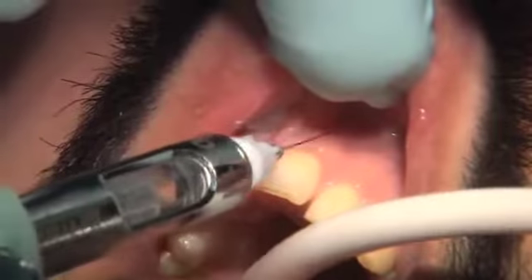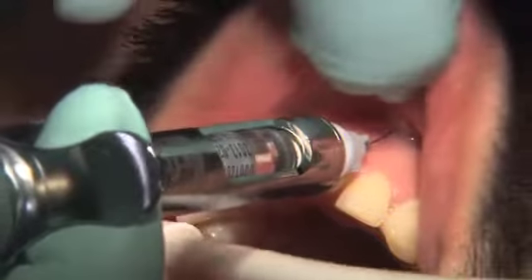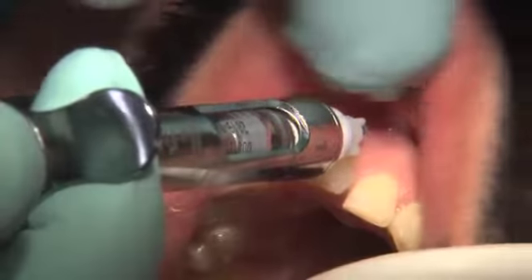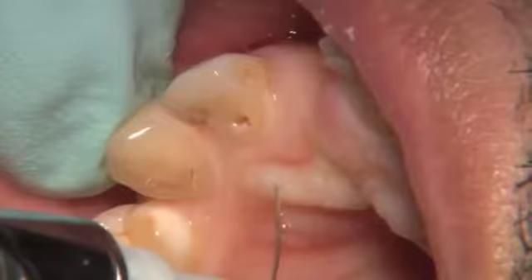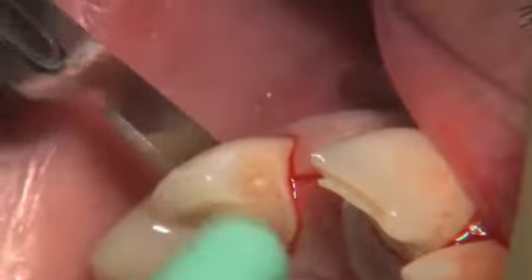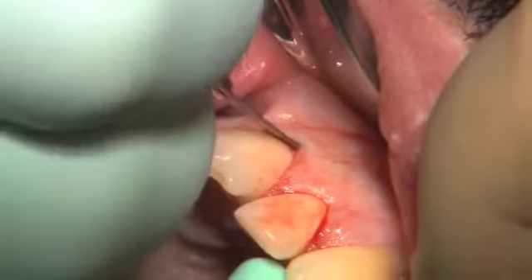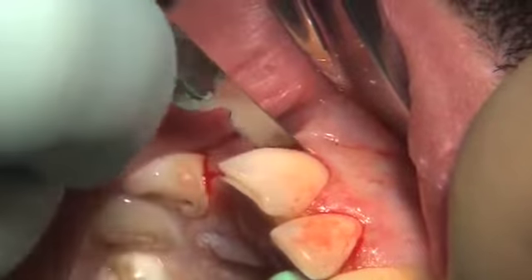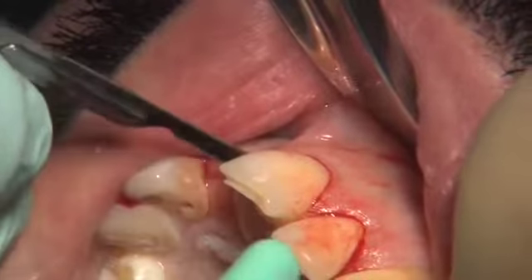Generally, we want to anesthetize the area two teeth mesial and distal to the proposed osteotomy site, as this will be important when the time comes to reflect the flap as well as reapproximate the flap in the future. A full thickness mucoperiosteal flap is developed utilizing a sulcular incision, and the incision around the osteotomy site is made slightly mid-crestal to slightly palatally. Again, great care should be taken with development of the flap to protect the soft tissue architecture that already exists and to ensure no laceration of the tissue.